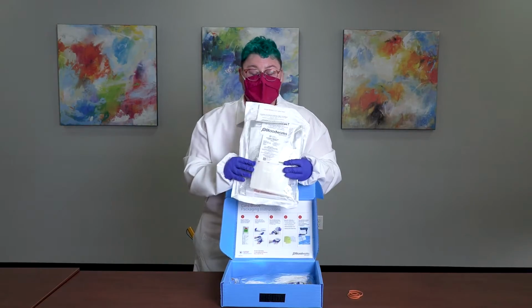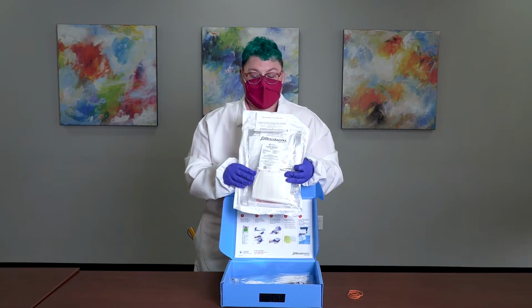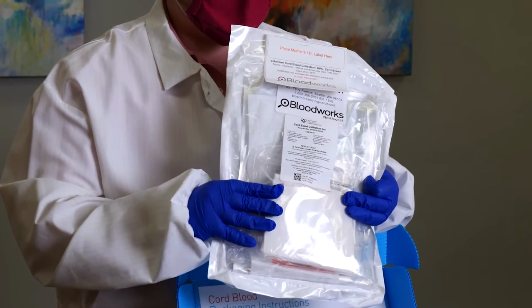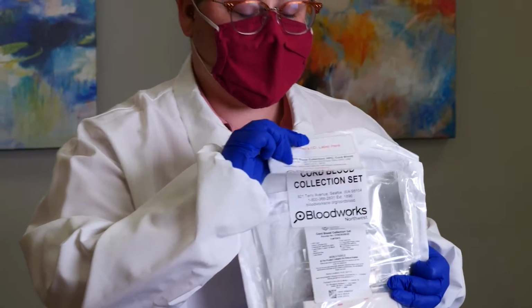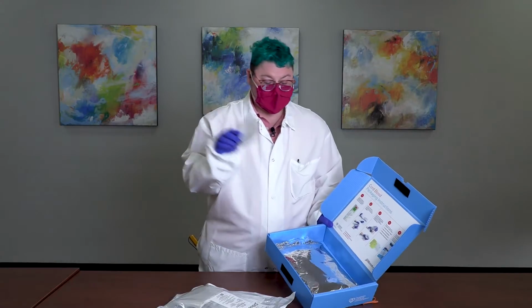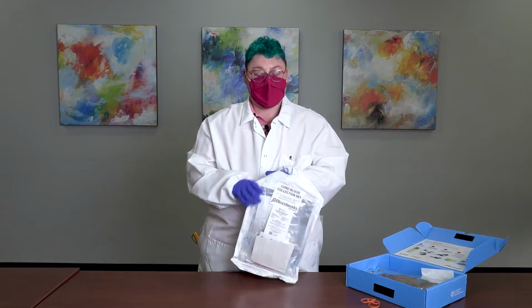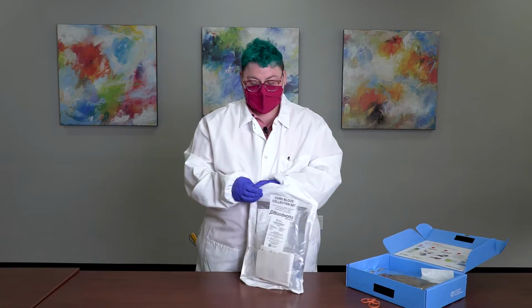There's supplies in here for your maternal samples, as well as the collection bag for a vaginal delivery by Fresenius Kabi. On the outside, we have the base label. You'll need to set this aside and put it in a place where you won't lose it, such as inside the box. When a patient has been admitted and they're ready to donate their cord blood, you can go ahead and collect the collection box and the collection set.